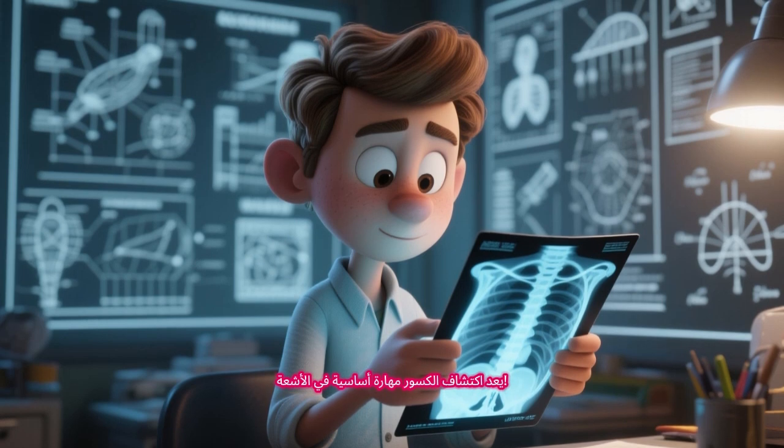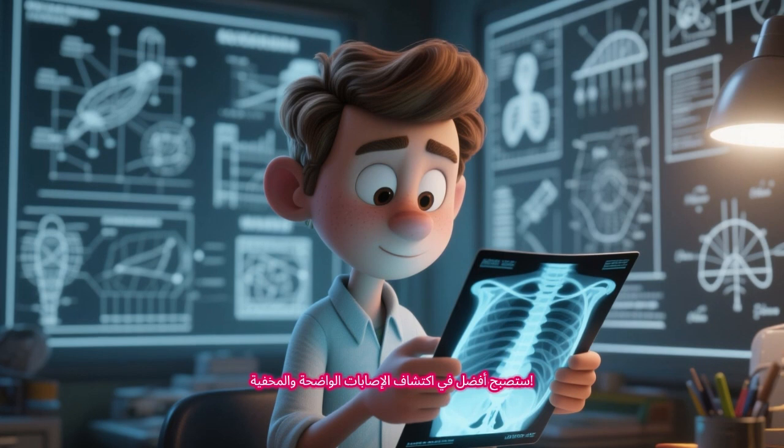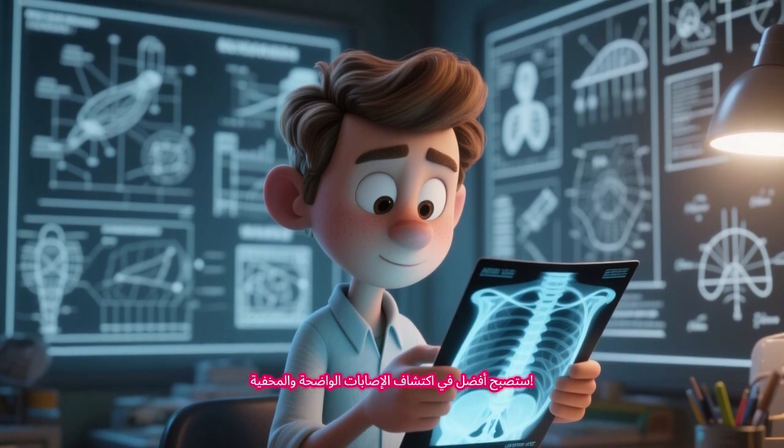Fracture detection is a core skill in radiology. With practice and a systematic approach, you'll get better at spotting both obvious and hidden injuries.